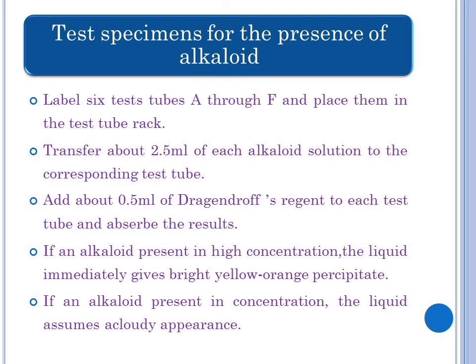Place the first chromatogram on a clean sheet of paper or paper towel. Transfer a couple of drops of Dragendorff's reagent to a cotton swab. Put the tip of the swab at the top center of the strip and wipe downward, dampening the center of the strip along its length until you reach the spot. If necessary, add more reagent to the cotton swab. The goal is not to soak the entire strip, but to dampen the area of the strip where the alkaloid traces are present.